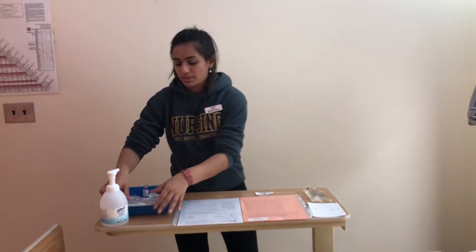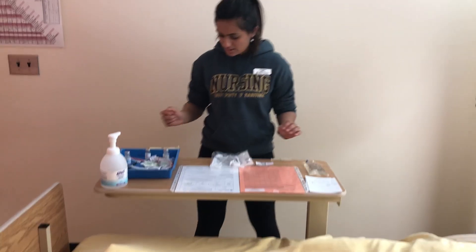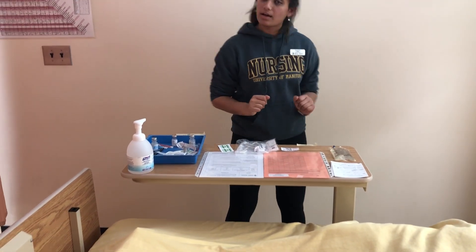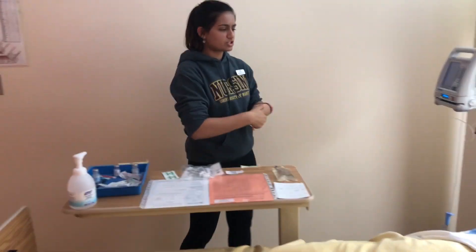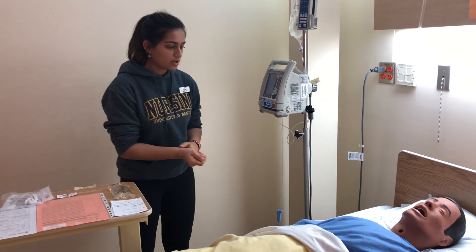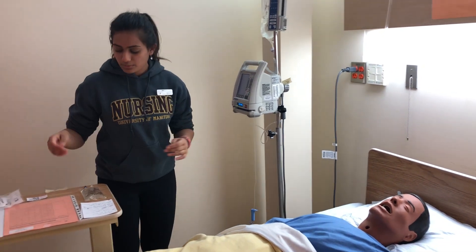Now I'm going to gather my supplies for the bedside: my tape that I've already prepared with my date, time, and initials, along with some alcohol swabs. I'm going to enter my patient's bedside, performing hand hygiene. As I enter the patient's room, I'm ensuring they're not in any signs of distress. The bed rails would normally be up, but they're down right now. The bed is at the lowest position and the patient is not in any distress.